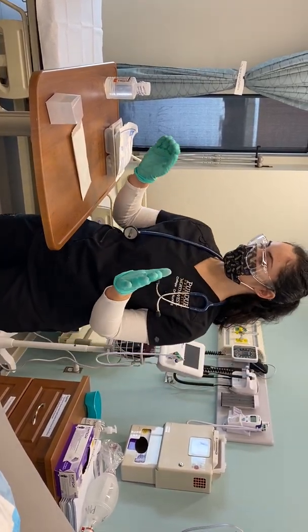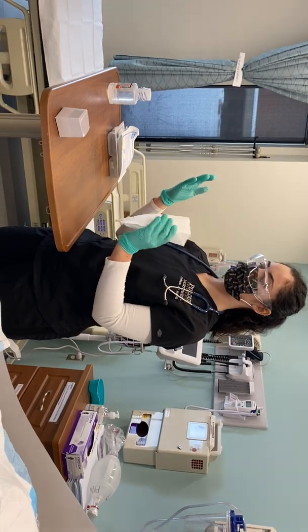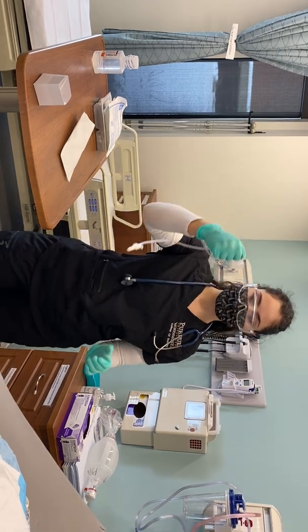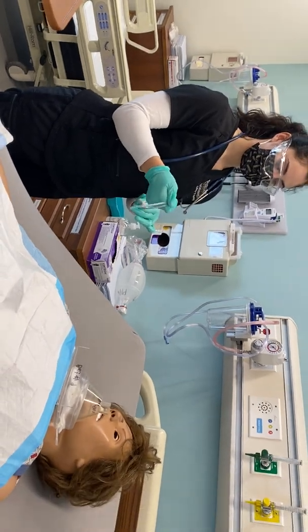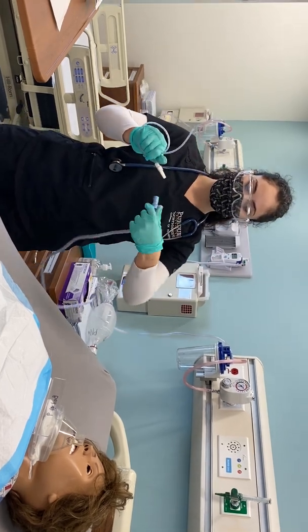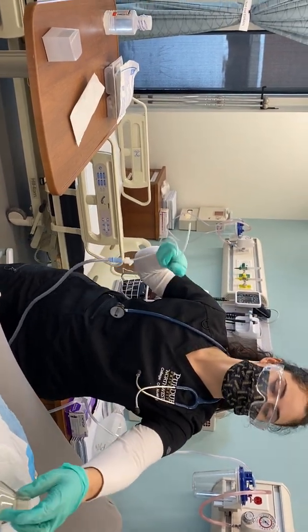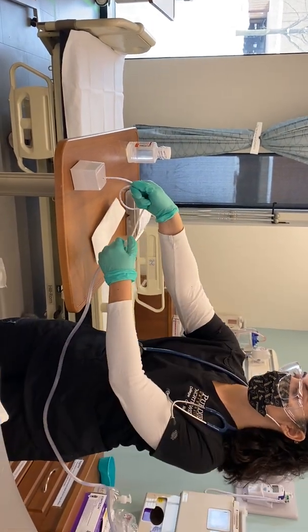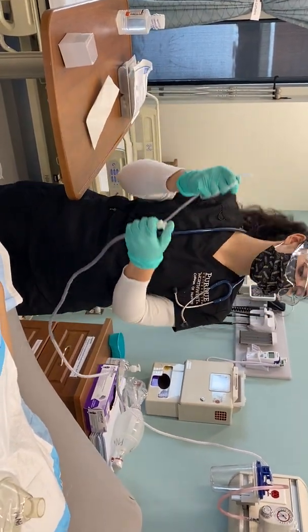Okay, with the sterile procedure still being in place. This is my sterile hand, this is my non-sterile hand. Okay. So with my non-sterile hand, I'm opening the package, pulling it out with my sterile hand to keep it sterile. Okay. And I'm going to connect the tube to it as well. All right, I'm just going to remove your oxygen mask, and now I'm just going to dip this in the saline. Okay, while suctioning intermittently.